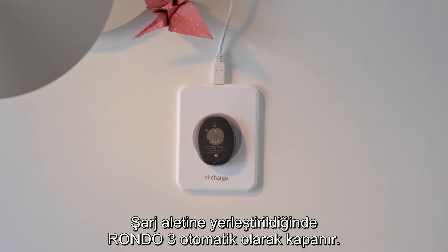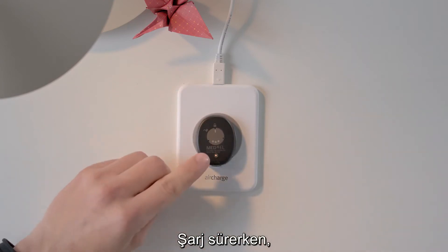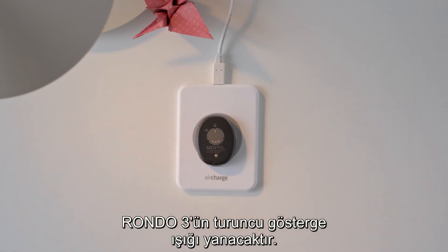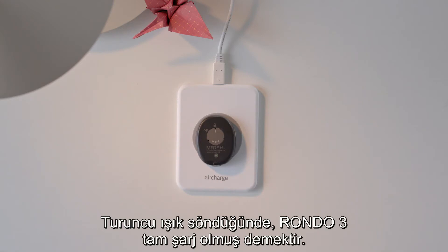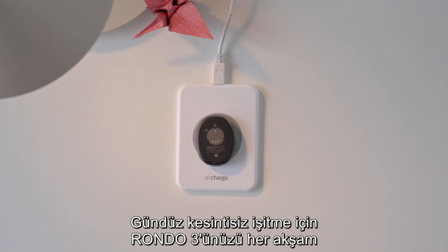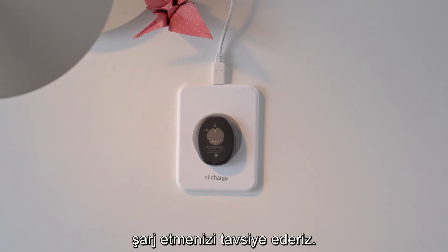RONDO3 will automatically switch off when placed on the wireless charger. The orange charging indicator light on RONDO3 will illuminate while it is charging. When the light goes off, RONDO3 is fully charged. This should take 2.5 to 4 hours. We recommend charging your RONDO3 overnight for a full day of hearing.